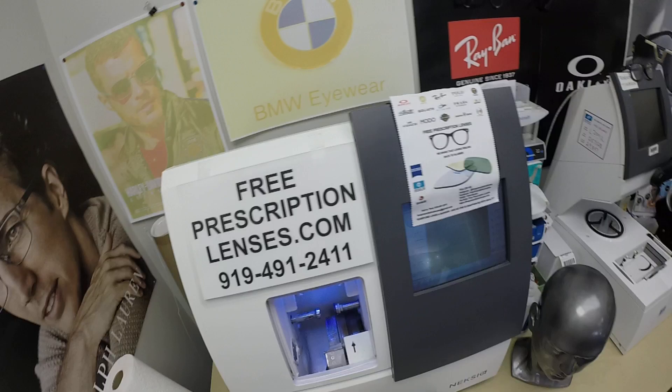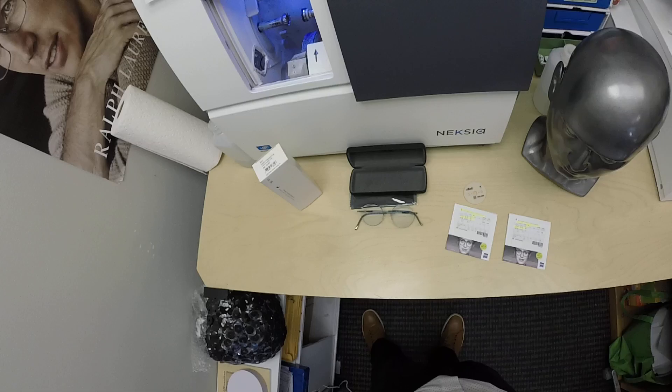Hi everyone, special thank you to Macy in Independence, Missouri. This is freeprescriptionlenses.com where everyone loves a bargain and no one is disappointed with quality. I am the hardest working optician in the industry.